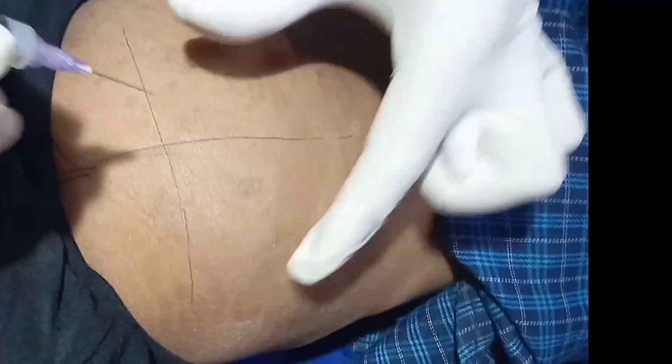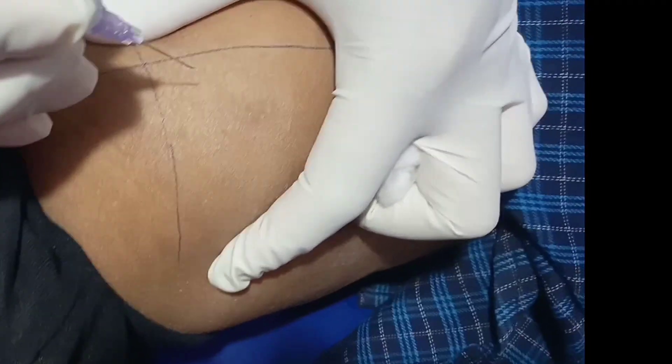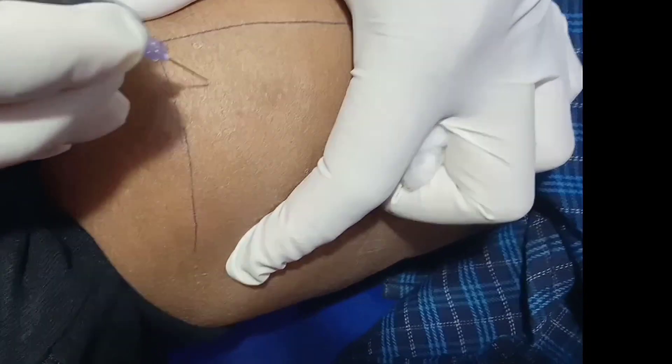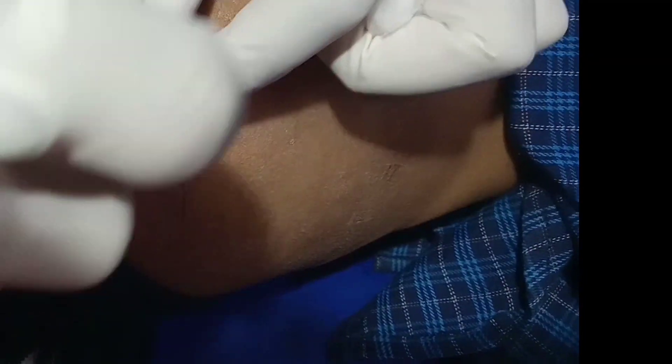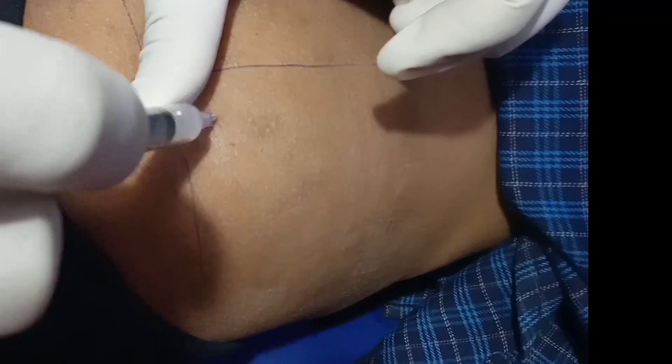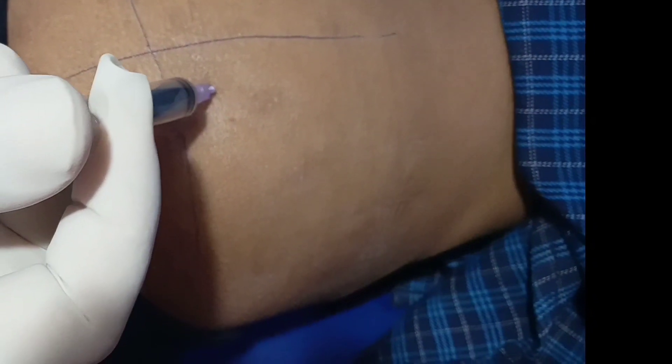After pushing the needle into the muscle, we have to pull the plunger back to see whether the needle is in muscle or vein. If blood comes, it means it is in the vein, and then we have to reposition the needle. As there is no blood in the syringe, we can push the plunger down to release the medicine.